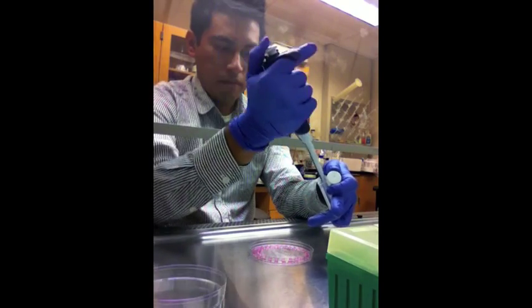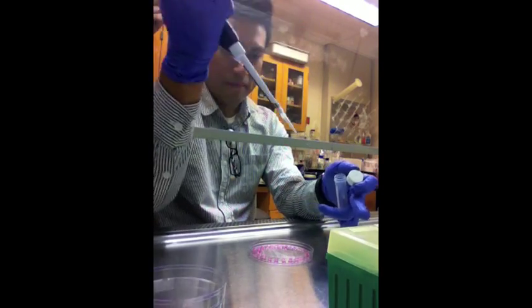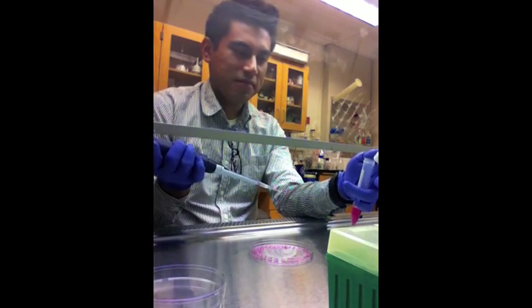Always use good sterile techniques. If your tip accidentally touches the outside, always exchange it for a new tip.